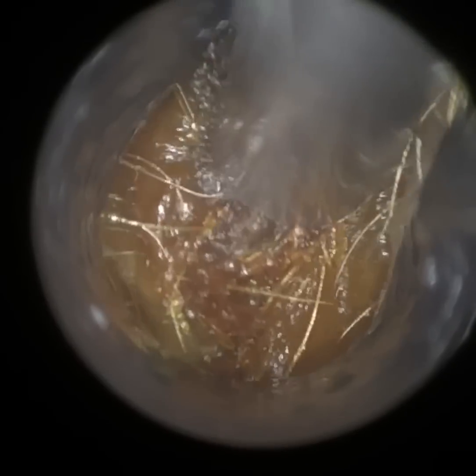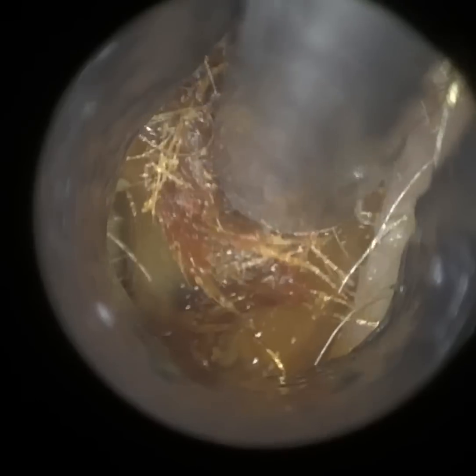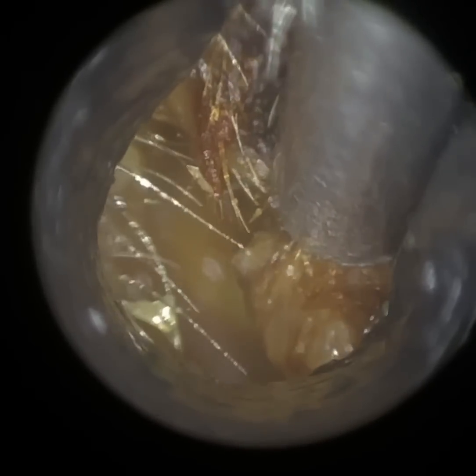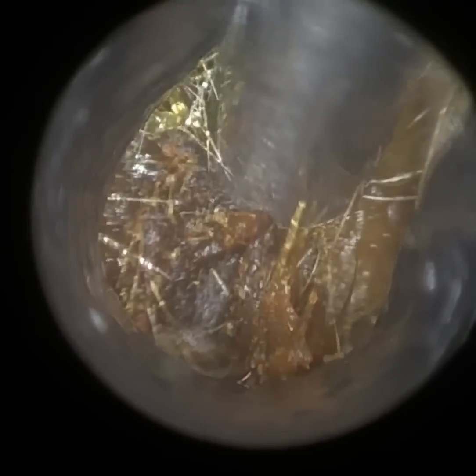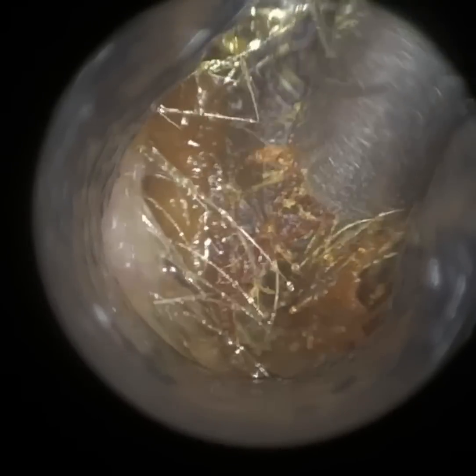With this side, it's a bit more difficult to remove. I'm just making this little wriggle movement to detach the wax from the sides of the ear canal. It is a lot more matted on this side, the canal is a bit narrower, and the core of the wax is a bit firmer. You may start to see at the bottom, as I'm lifting this up, there's a bit of discharge underneath this plug — a bit of green discharge, a bit of an infection. I've managed to obtain a suction grip, and I don't want to lose it. I'm going to very slowly bring this wax plug forwards, manipulating it around the curvature of the ear canal through the first and second bend.